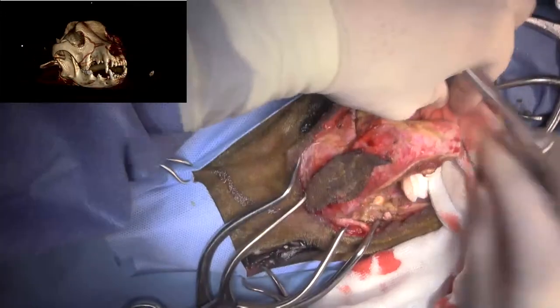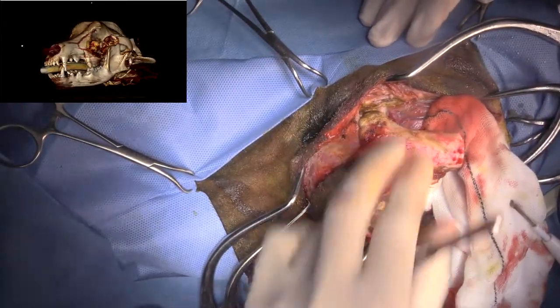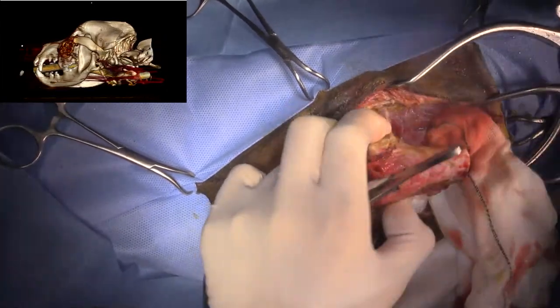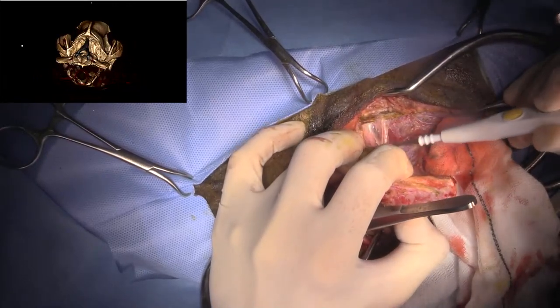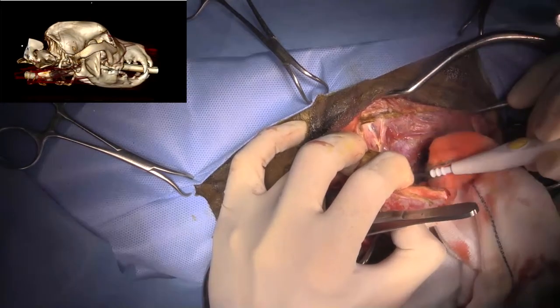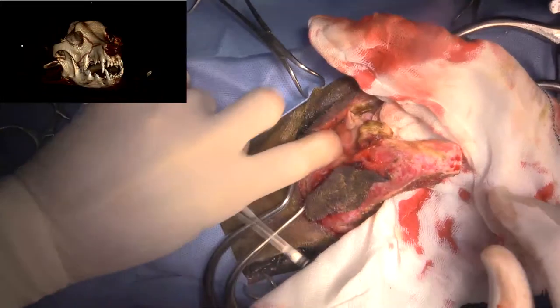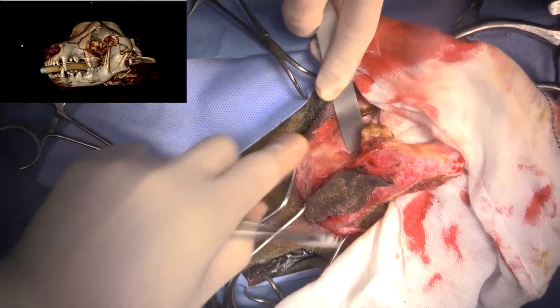So just keep that packed off there. So I've released it up here. I'll just cut through that a little bit more, up through the zygomatic ligament. Okay, and so that's getting into the orbit there. You can start seeing some periorbital fat. So that's globe right there. That's the maxillary bone there. So I think I'm going to start dissecting it there.